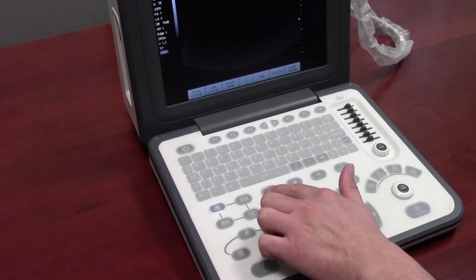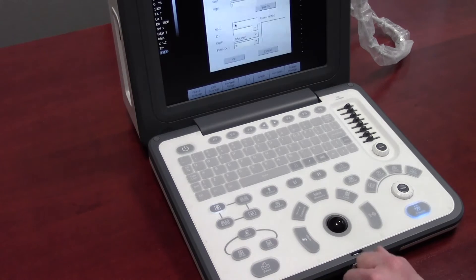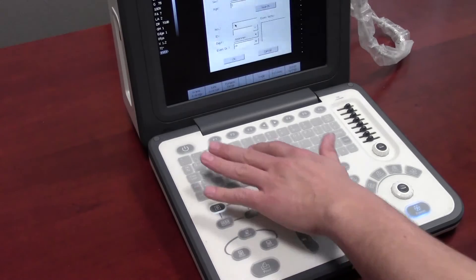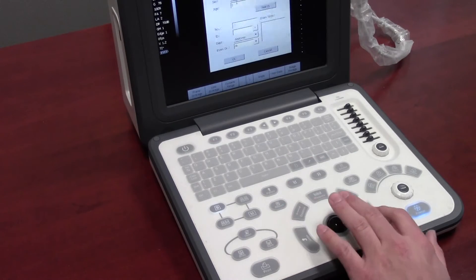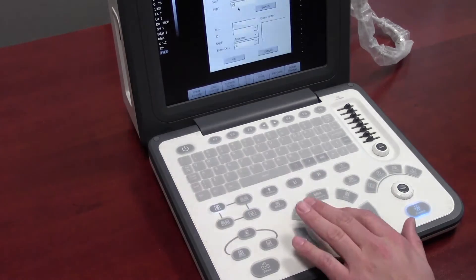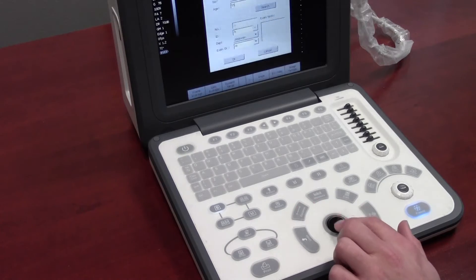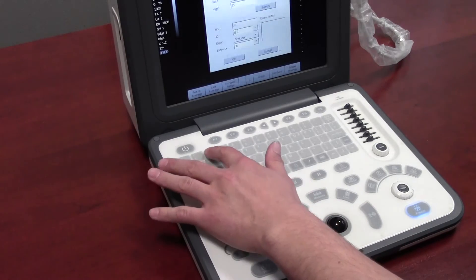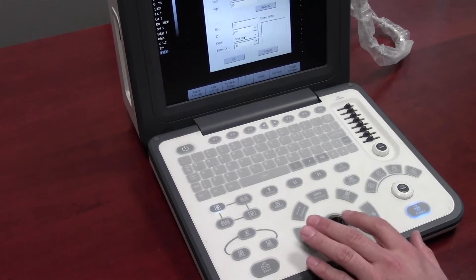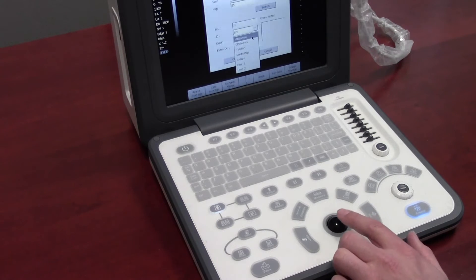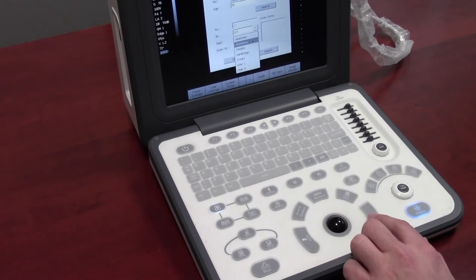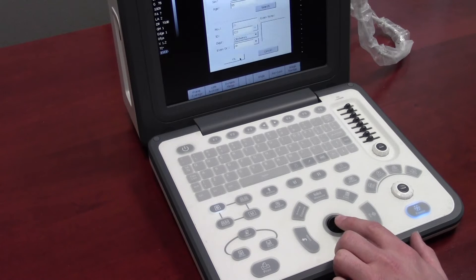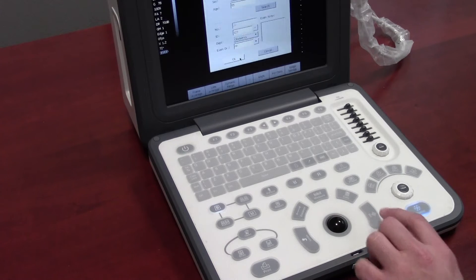The next thing you want to do is start a new patient by pressing the patient key. Input your information. Make sure that your ID number is specific to that particular patient. The department will relate to the application. You can also add the doctor's name in here and press OK once you're finished.